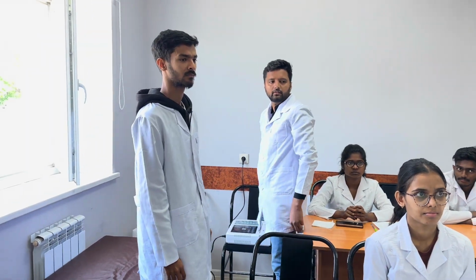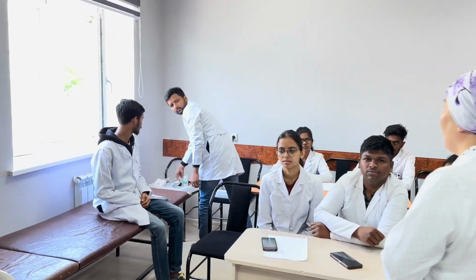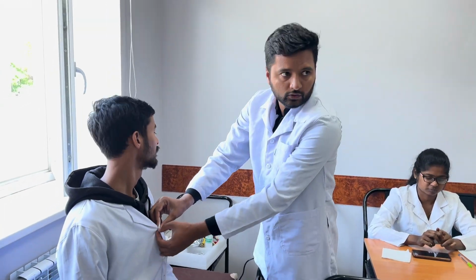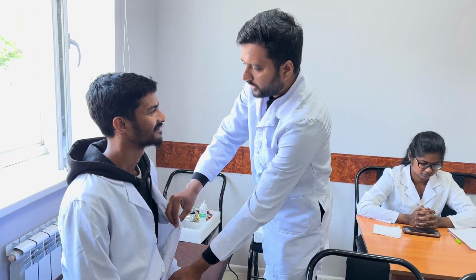For examination, we're using some rules. First we remove the clothes of the patient. Please ask the patient to remove the upper part of the clothes.